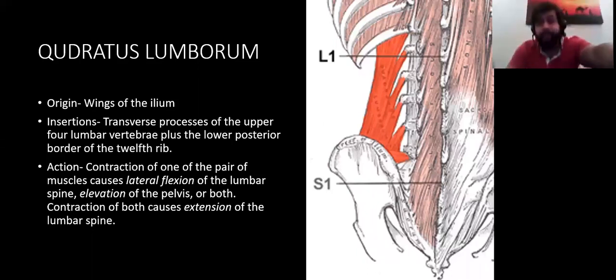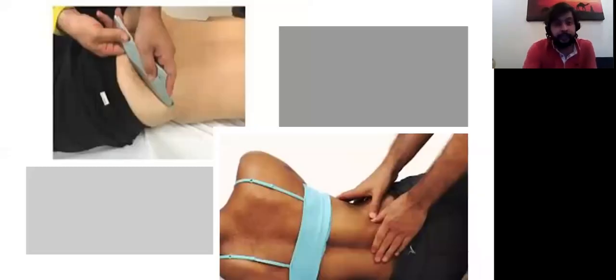So this is all about that. Even if the patient feels the stroking is a little tough for them, you can go for an ischemic compression to the part and use IASTM. You can use MET while using IASTM. It all depends upon you. Whatever techniques you can combine IASTM with, you are free to do that. I think, yes, this is how it looks.